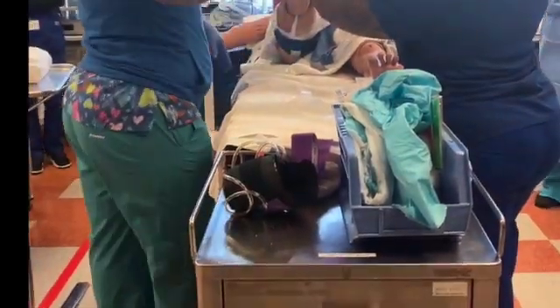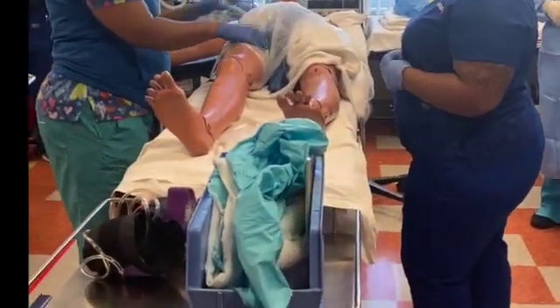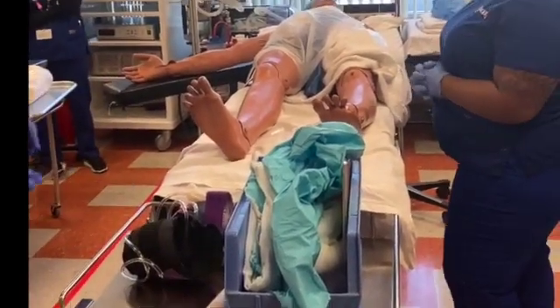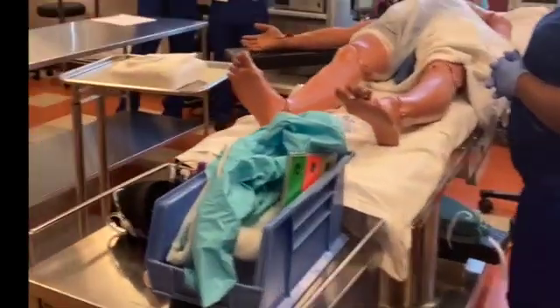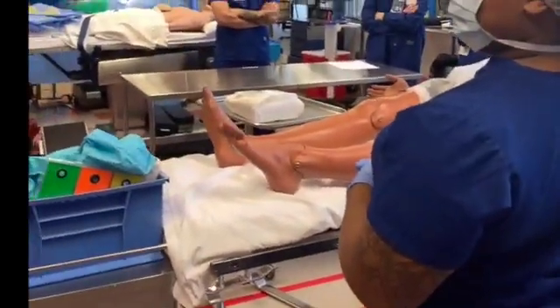Okay, check the pressure gauge and inflate the tourniquet to the designated pressure. All right, what's next? Inflate it. If a commercial prep applicator is used, the student is able to describe the correct technique for product. Okay, so now I'm taking off my purple gloves into the trash. I'm going to wash my hands, performing hand steps.